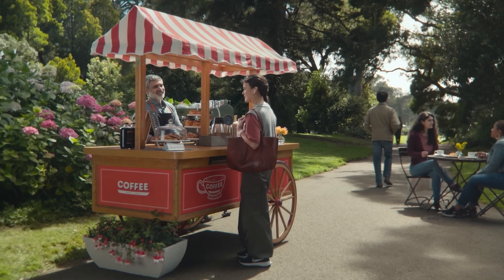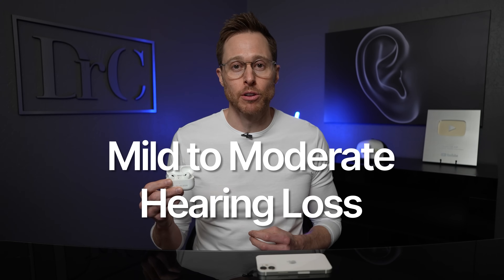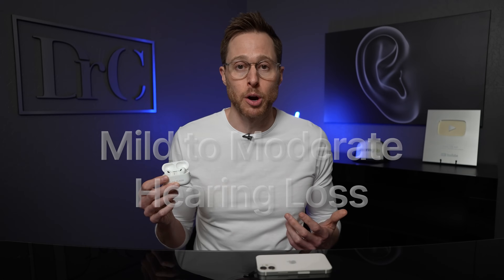With the new Apple iOS 18.1 software update, you now have access to a hearing aid feature with your Apple AirPods Pro 2 if you live in an approved area like the United States. This update officially turns the Apple AirPods Pro 2 into official over-the-counter hearing aids per FDA guidelines, meaning that if you're an adult with perceived mild to moderate hearing loss, you may be able to use the AirPods Pro 2 to treat your hearing loss. You have to set these up the right way, and I'm going to walk you through this entire process step-by-step with helpful tips along the way.